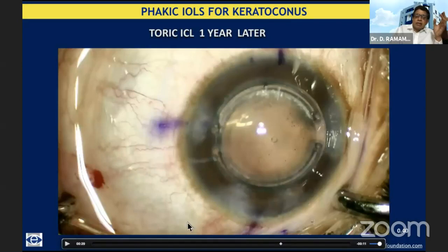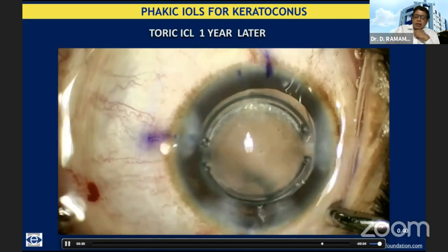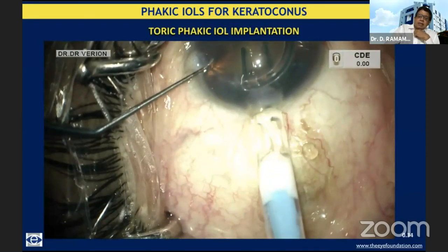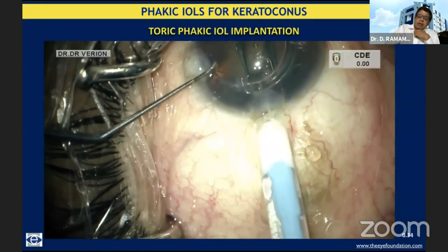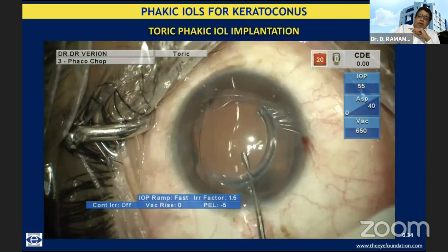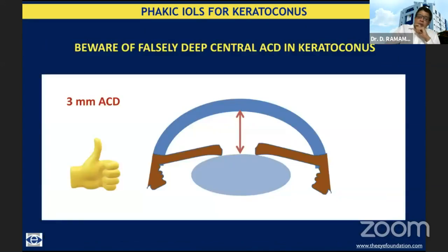This is just to show you how the lens gets centered very well. This is one of our earlier cases — actually an iatrogenic ectasia case. You can see the post-operative picture with the INTACS and the toric ICL in place. And this was an extreme degree of keratoconus where we did just a single segment with collagen cross-linkage, waited almost one year, and subsequently implanted a toric IPCL for the rehabilitation of this patient. One caveat: because of the central bulge in keratoconus patients, you should be very careful about the measurement of anterior chamber depth.